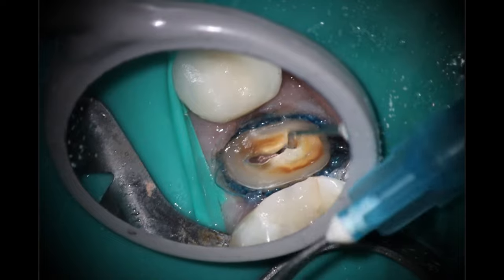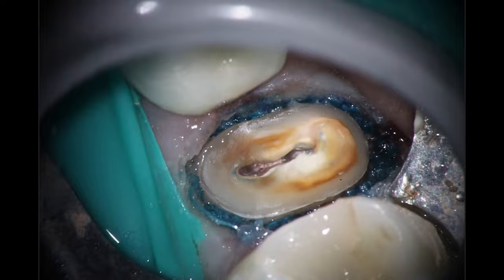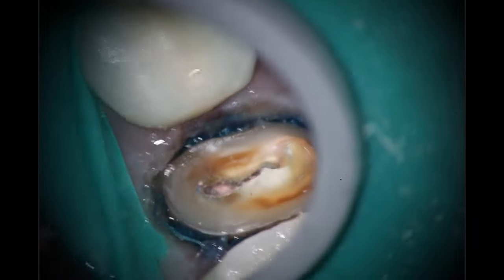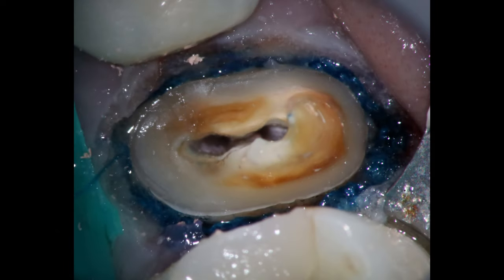Going in here to get that pretty picture — I always love seeing the difference switching to those mirrors; the Zerc mirrors with photos are so much better. Looking pretty good: the bleeding has all stopped, the cord is doing its job. There is a little bit of gutta-percha still inside, so I used a 15 hedstrom file to get that area out between the isthmus. You can put a right-hand bend on there; going in with a 25 to loosen up and remove that piece. Looking nice and clean, no bleeding points — ready to start the bonding process.